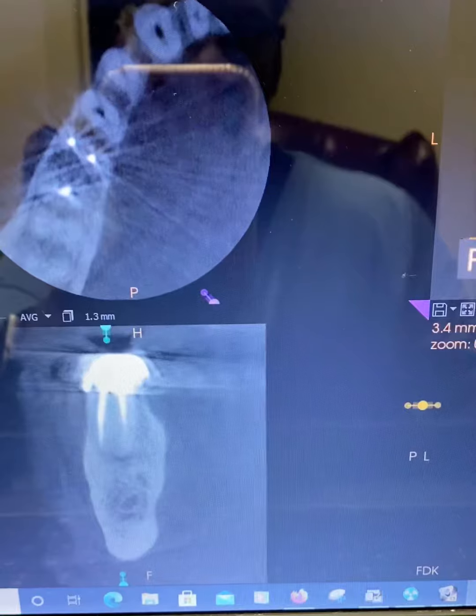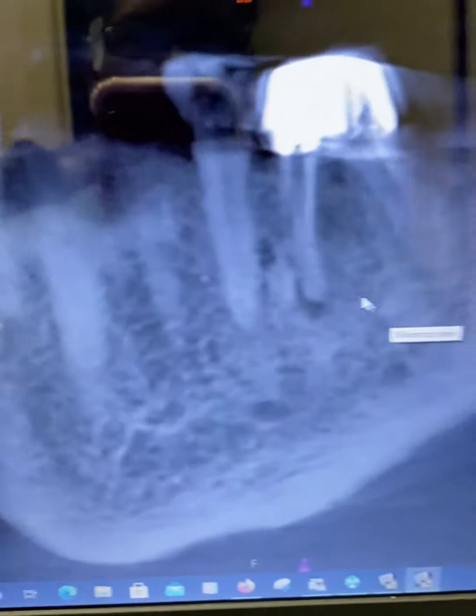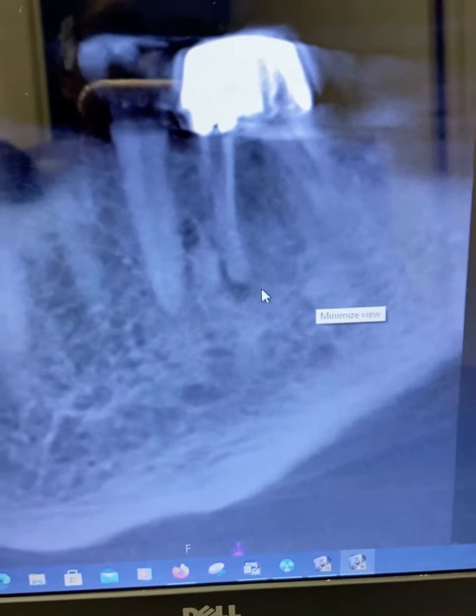You can see the mesial lingual is actually short probably about another three or four millimeters. We also see the pathology on the limited field of view 3D CBCT from the coronal slice. Looking at the sagittal slice, we can see clear pathology there. So we decided to do a retreatment on this case.